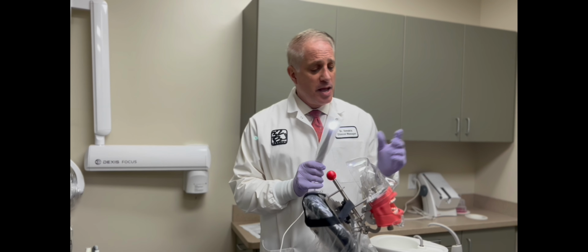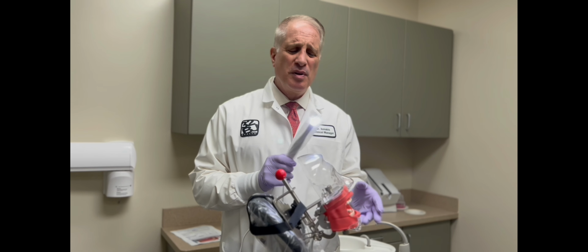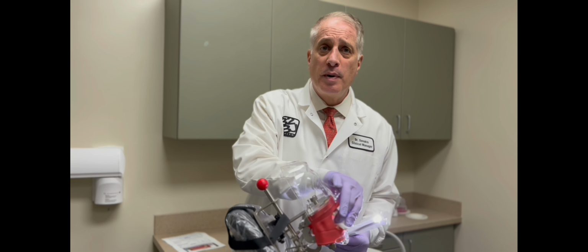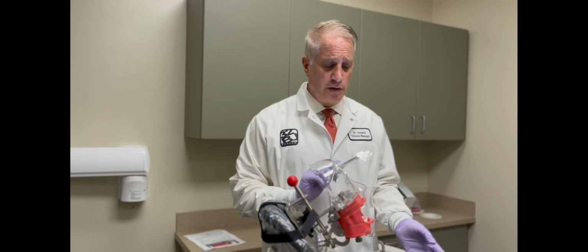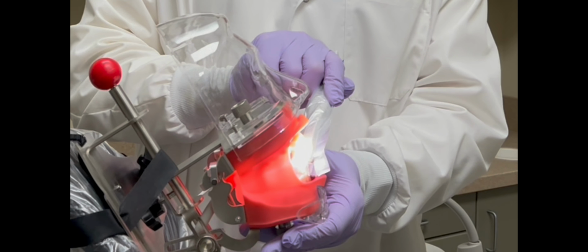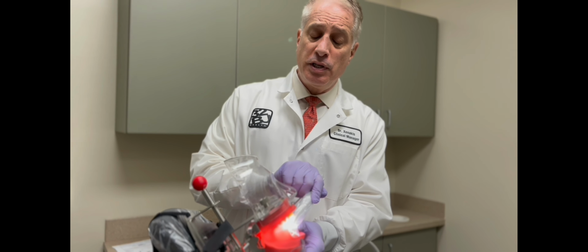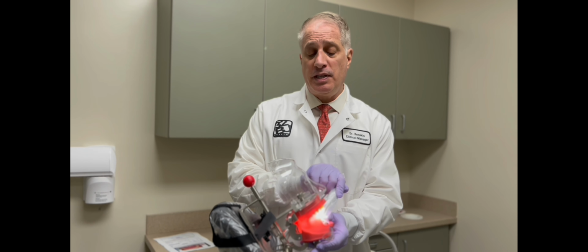Here is where practice makes perfect. You need to experiment on your own to see what is comfortable for each patient. Each patient is slightly different. For example, before we begin, the teeth need to be dried with a 2x2 gauze. And there are a few different techniques I will show you. There's the cross-arch thumb fulcrum technique. It's important to have a solid resting point. Here I am resting the camera on my thumb, taking a picture of the opposing arch. So my thumb on the lower arch is taking a picture of the occlusal surfaces of the upper teeth.